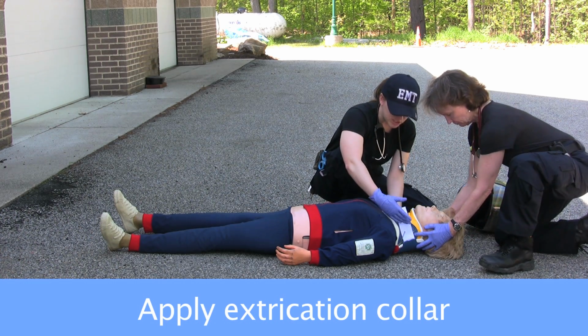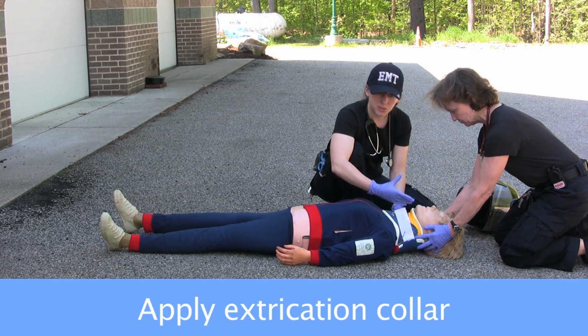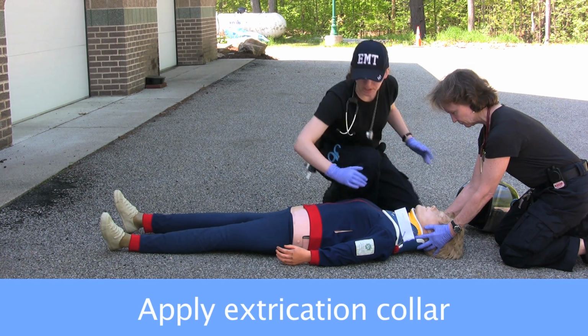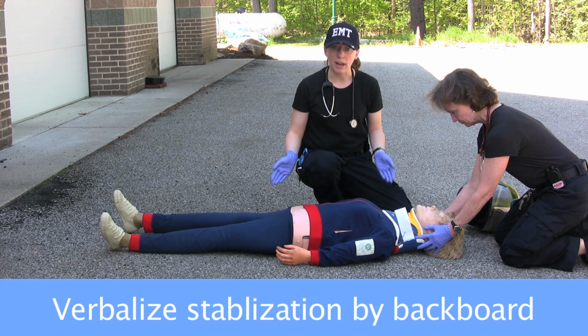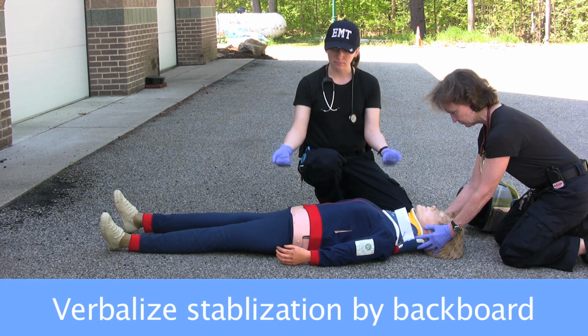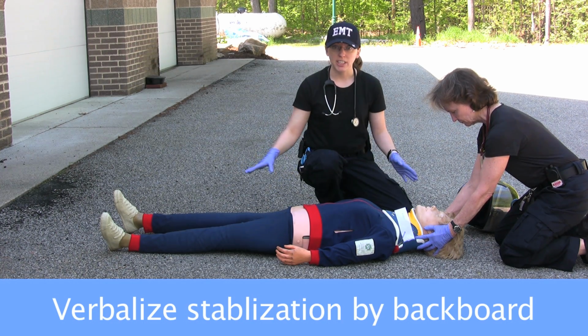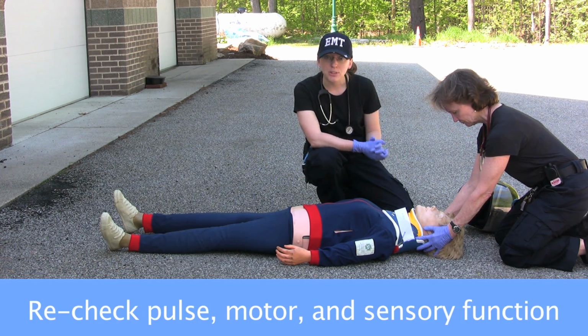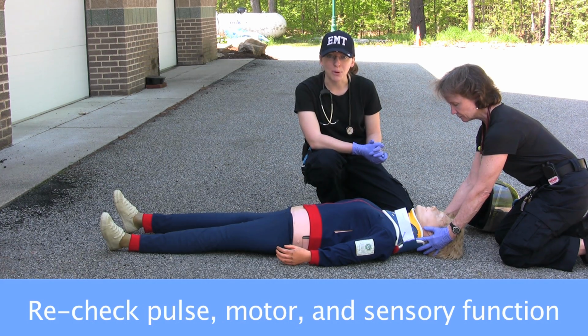Okay, so the collar looks like it's fitting pretty well, and patient's not having any respiratory distress with it, so we're good. Our next step is to move the patient to a backboard. We'll log roll her onto her side, then onto the backboard, strap her in, and then recheck for pulse, motor, and sensory functions. And that is how you remove a motorcycle helmet.